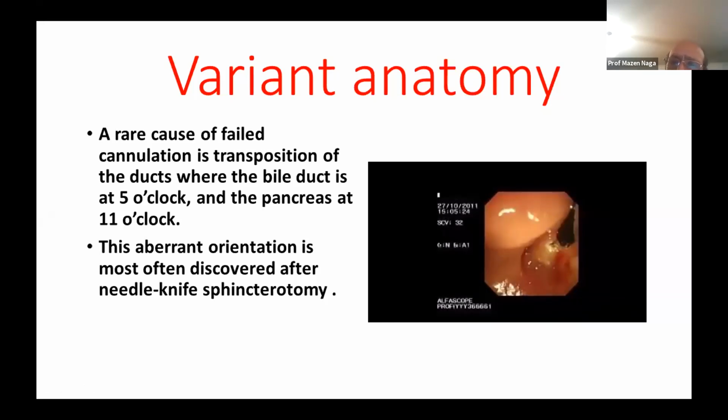Then we cut the mucosa and expose the muscle layer after several cuttings of the mucosa to reopen the muscle layer. We can see it here below, but it will be more apparent after cutting the mucosa a little bit more.